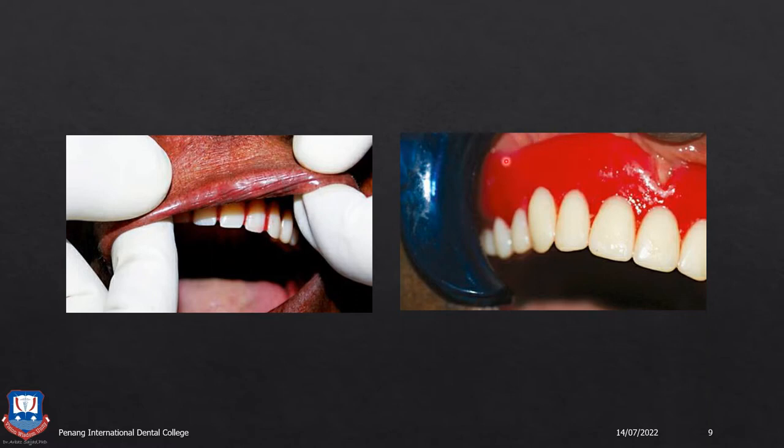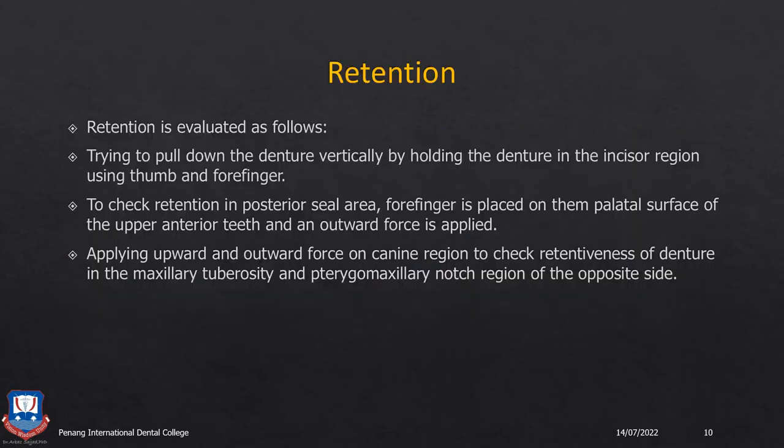So the mucobuccal fold has to be visible just above the denture border. All the proper frenum reliefs, like the buccal frenum and the labial frenum relief, should be given at this trial denture step, so that you show that the peripheral and relieving structures have been accurately recorded in the previous step. And of course, you also check the aesthetics, such as labial fullness.